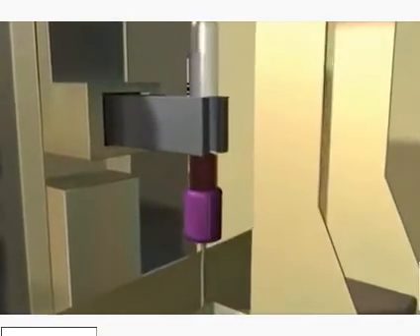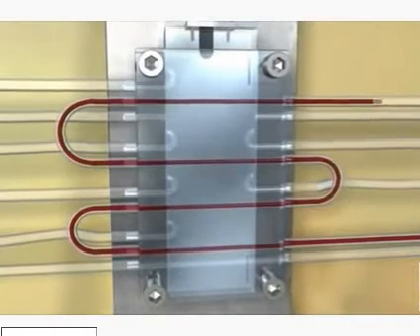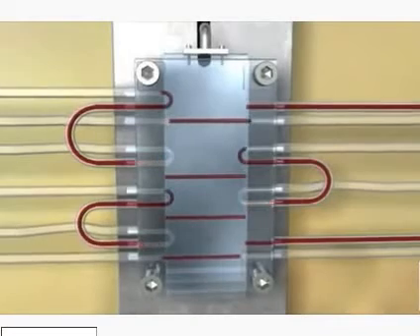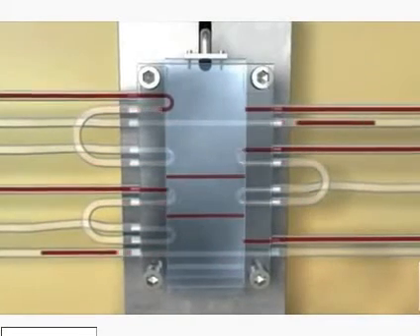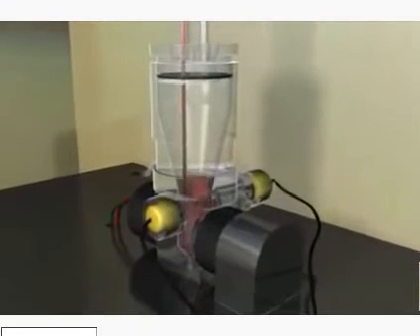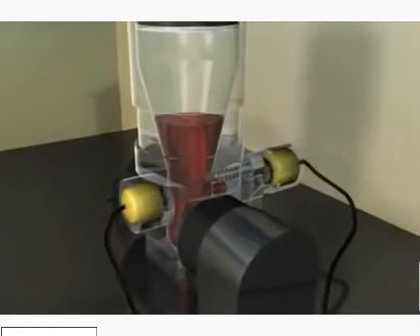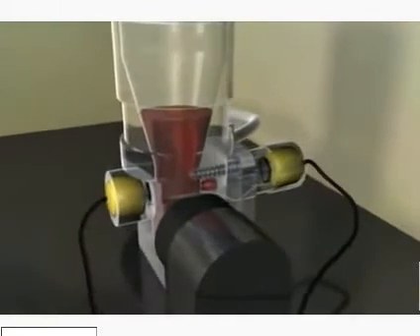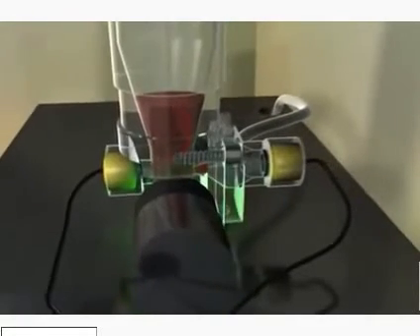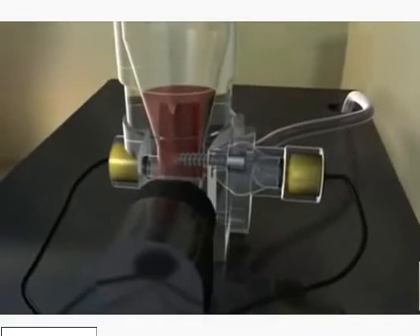Here the blood sample is taken, and in this method we cannot determine manually, so the automatic method is chosen for counting the blood cells, that is, the blood quantity. Here is the structure where the blood is delivered to the counting instrument.